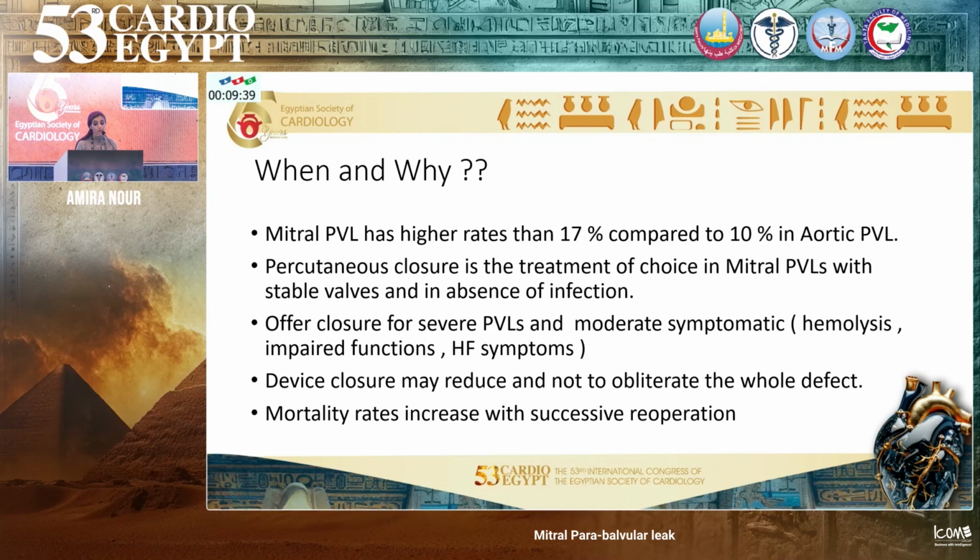We offer closure for patients who have severe PVLs or even those who have moderate but are symptomatic in the form of hemolysis or heart failure symptoms. And device closure may reduce and not completely obliterate the whole defect. And of course, the catheter option is more appealing as the mortality rates increase in those type of patients with successive reoperation.